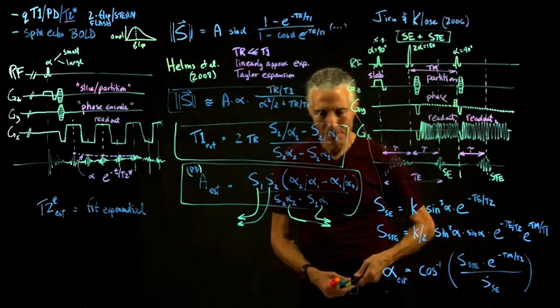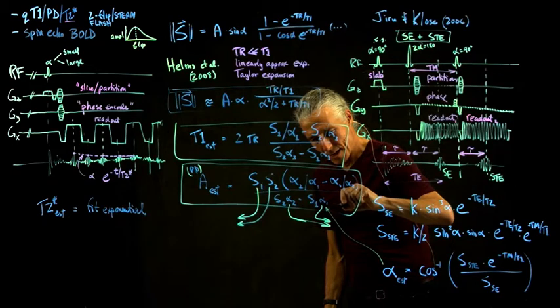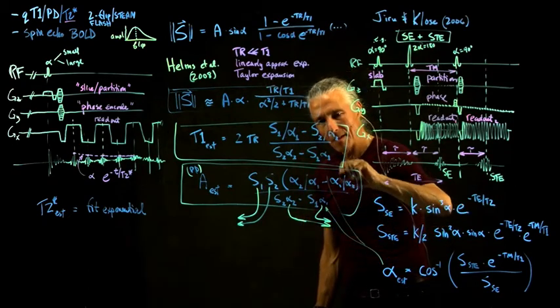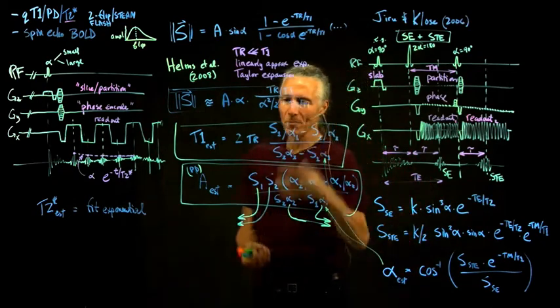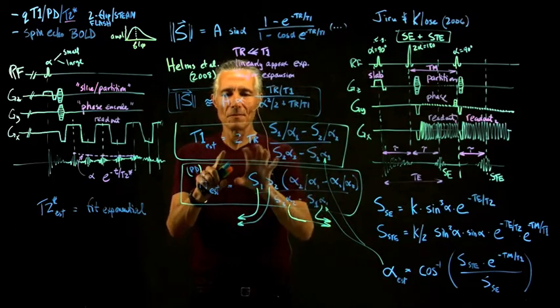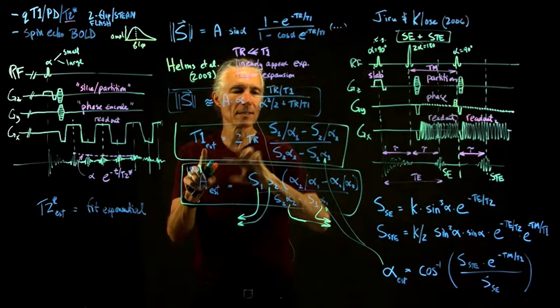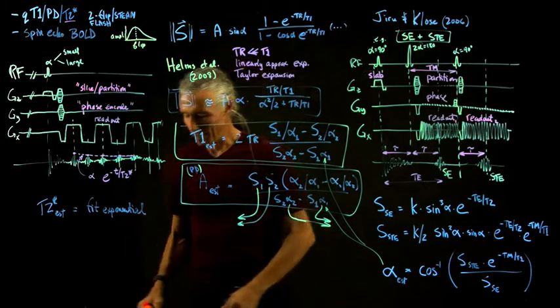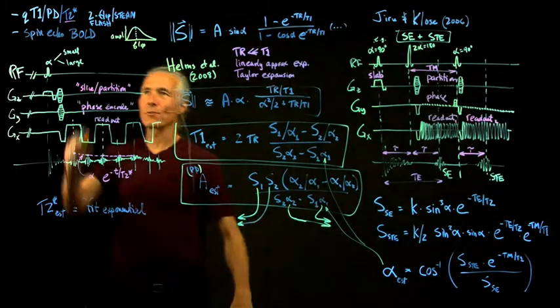So we take that and substitute it into these equations here. We've simultaneously solved those equations. Once we substitute that in, we can get our corrected estimate. So that's an example of how you would try to do everything right.